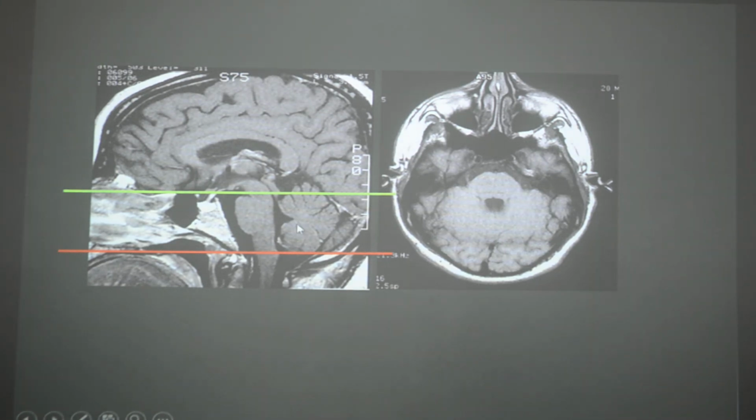Now, is this CT or MR? MRI. Why is it MR? We can visualize soft tissue. Okay, different planes, good. Okay, what is this white structure? Skull. So if the skull is white, it should be CT. Sometimes. Okay, skull bone, what is above the skull bone?